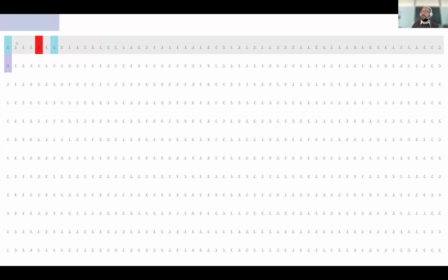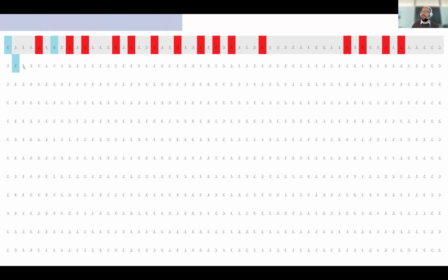This is what I will tell the subjects who are looking at me, or really looking forward to performing the task. Let me just remove my own face from the screen. They will have to select the items, as you can see, with the 3 dots. So this bar is already too late. It got blocked. So I will try to select more and more. You can see you have the pressure of the time on the top.